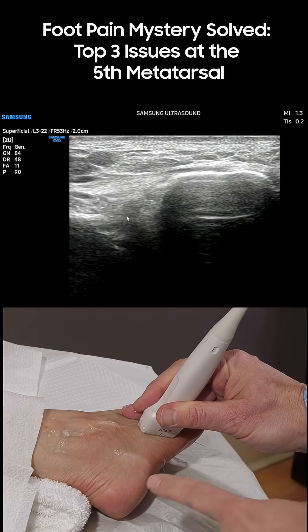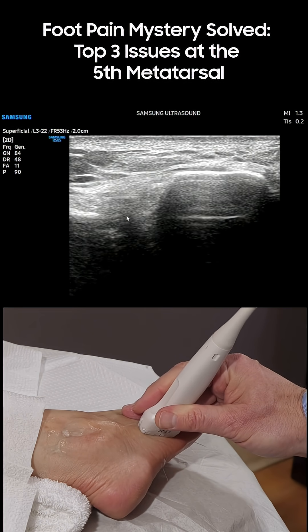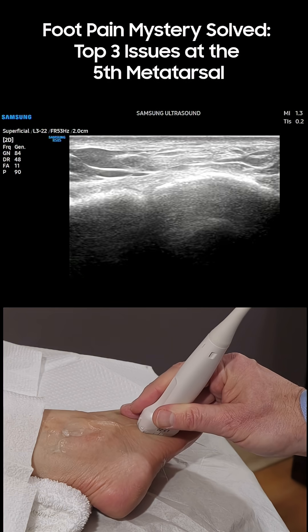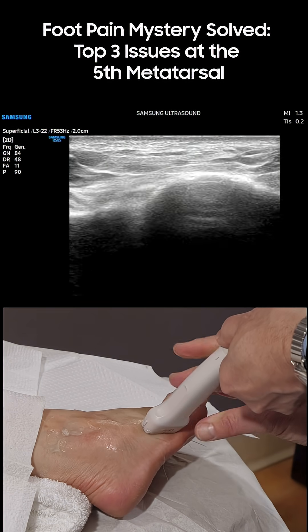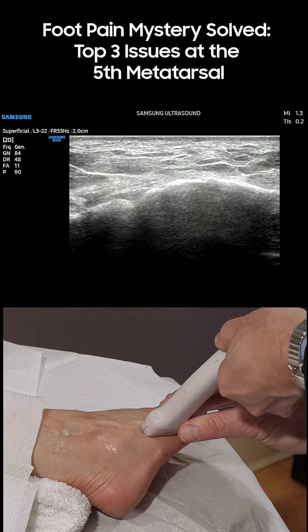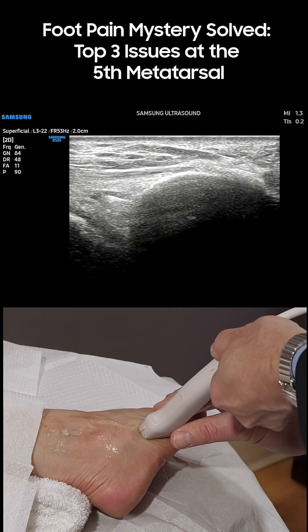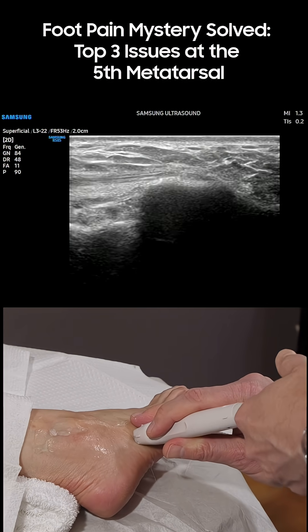What's important is that many patients are going to have plantar fasciopathy of the lateral part of the plantar aponeurosis. To look at that, when positioned on the fifth metatarsal, simply move the transducer more plantar.